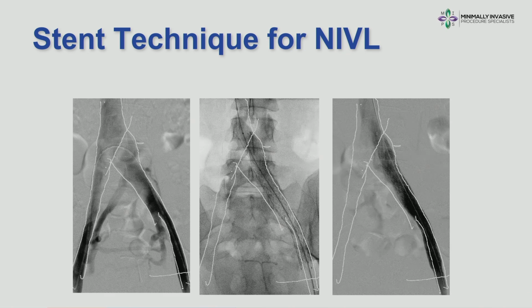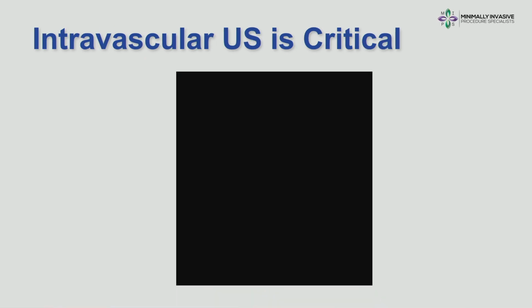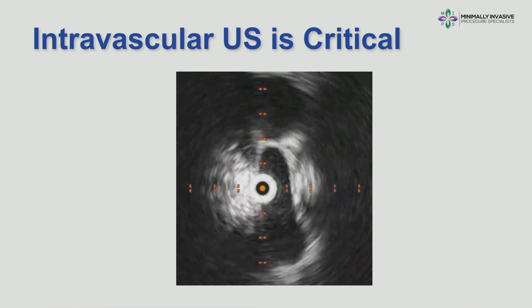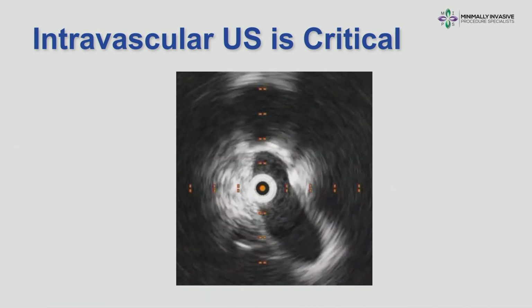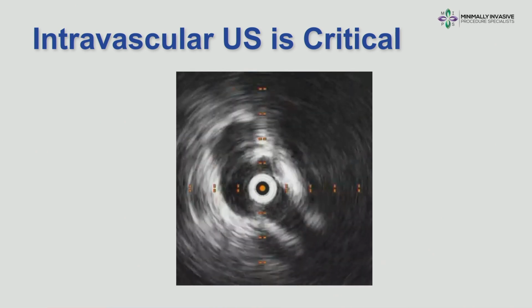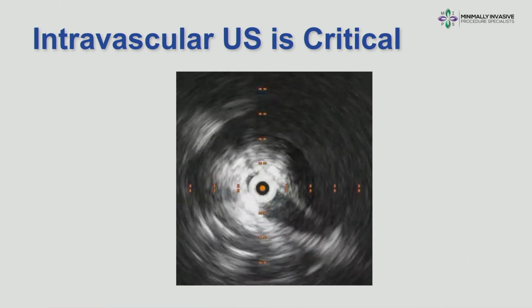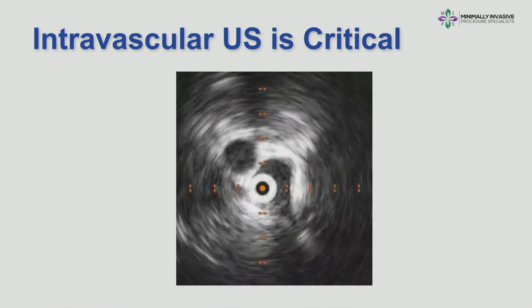The existing data is very confusing about whether or not we can safely place stents or not, and we'll look at that briefly. I know Patty showed you one method of how she does non-thrombotic stents, and this is how I do it. I literally mark the screen if I can see the crossing vessel, because as the stents start to deploy, the artery can push on them, they move, they twist, and it's really good to have a fixed thing on the screen that your eye can focus on. Then I perform the intravascular ultrasound to measure the size of the inferior vena cava. As the artery crosses, then I measure the stenosis. You can do it by cross-sectional area or diameter. In the VIDIO trial, 61% by diameter was what was used to be most accurate with symptomatic improvement, but that was for lower extremity stuff and not for pelvic pain.